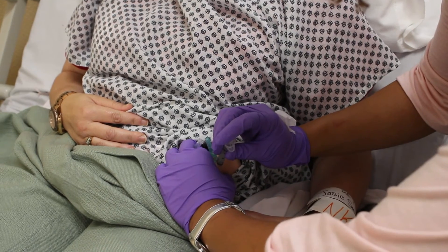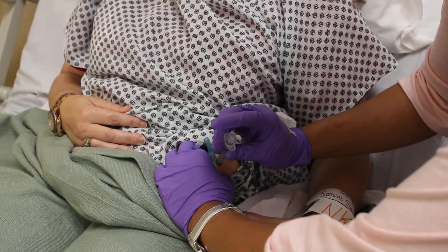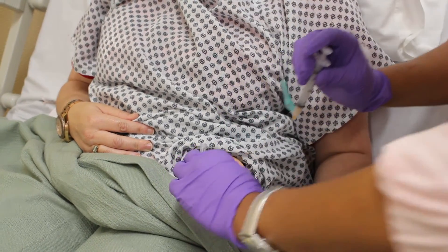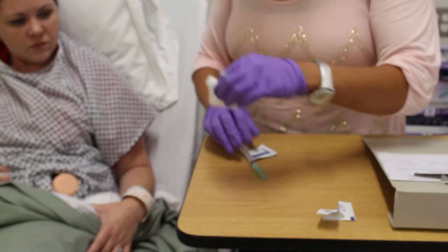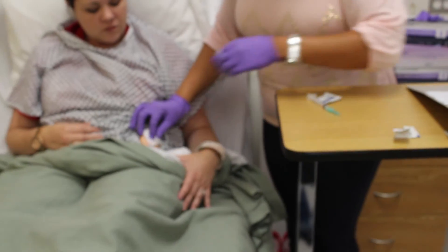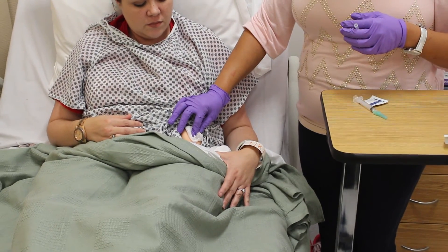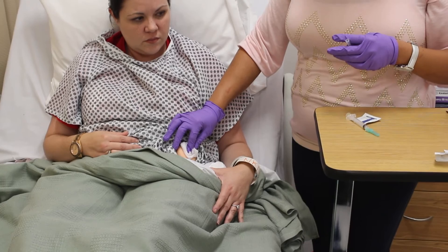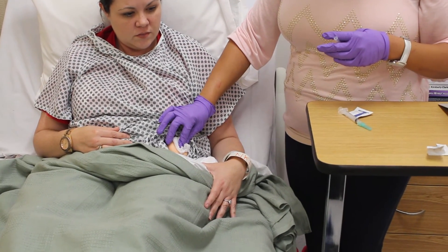I slowly push the medication in and wait just a few seconds before withdrawing the needle. I take the needle out and apply pressure on the site. With heparin, it is recommended to hold pressure for about one minute — this helps the medication not to leak out. So I'm holding pressure for a little bit.